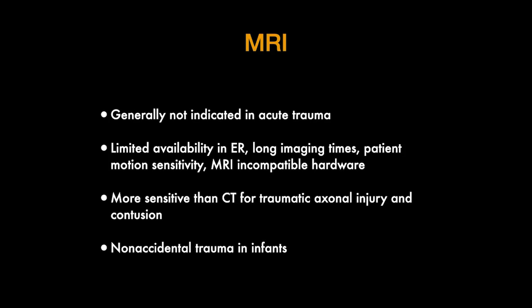It is more sensitive than CT for traumatic axonal injury and contusion. However, if these are significant, these will be seen on a non-contrast head CT in the acute setting. It can be useful for detecting hemorrhages of different ages when one suspects non-accidental trauma in infants.